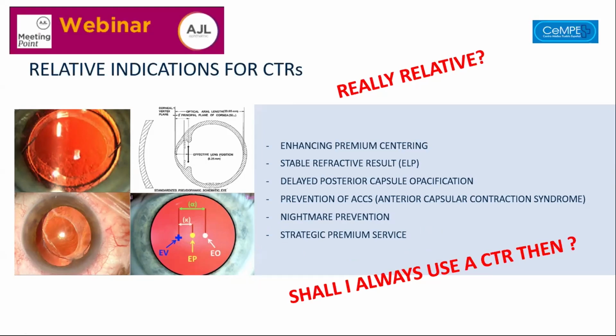It may happen that you implant a multifocal lens, and in the first 3, 4, 5, 6 months, the patient is not happy and does not adapt to that vision. So you start thinking of replacing the lens with another one, maybe a monofocal or another system of multifocality. And you may know from your own experience that some of these patients get adapted.